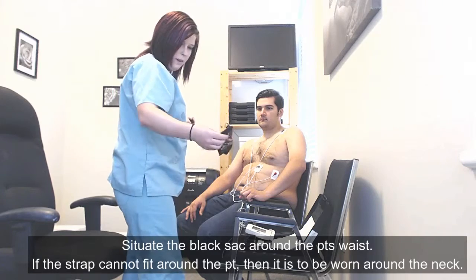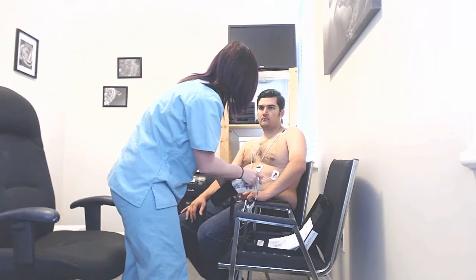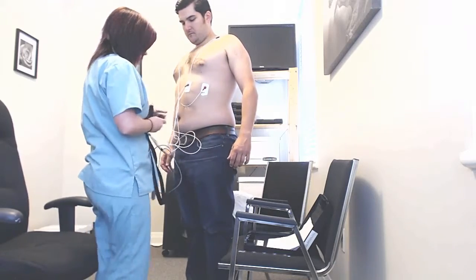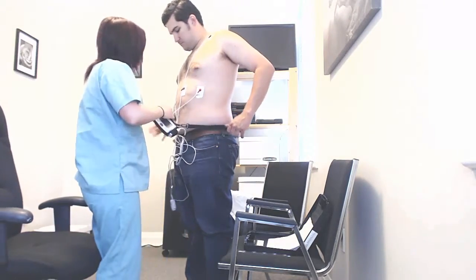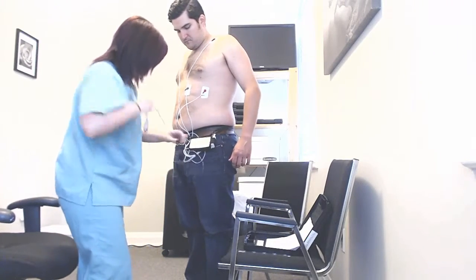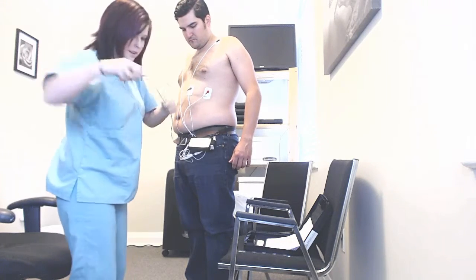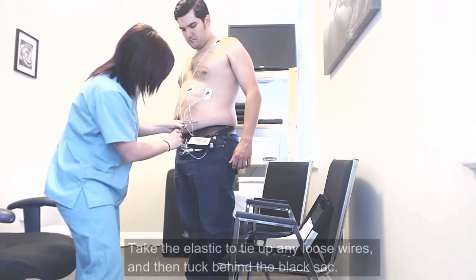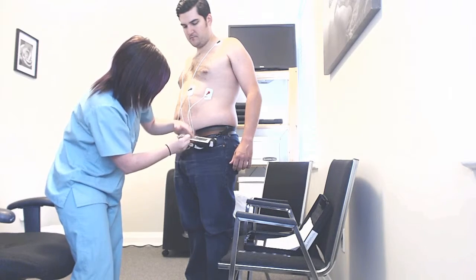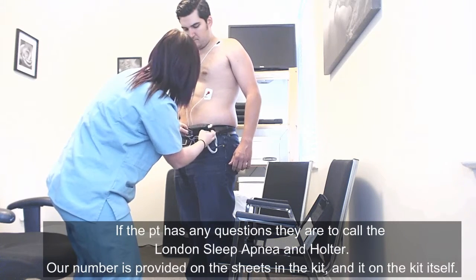We situate this sack around your waist, but if you feel more comfortable, you can put it around your neck. If you toss and turn in your sleep, put it somewhere where you feel you're not going to roll on the machine. We'll get you to stand up and grab the strap. I have an elastic here to gather some of the wires, which we'll tuck into the back of the black sack. Some patients also like to put this in their pocket — however you feel comfortable.